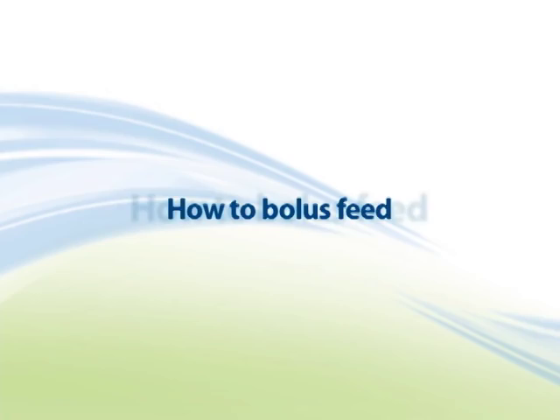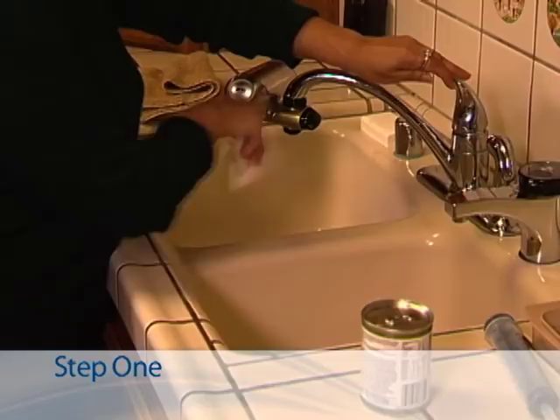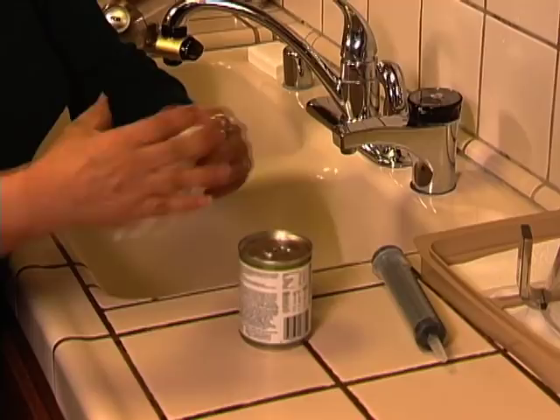How to bolus feed. Step 1. Wash your hands and clean off the top of the formula can with a damp paper towel. Shake the can well and then open.